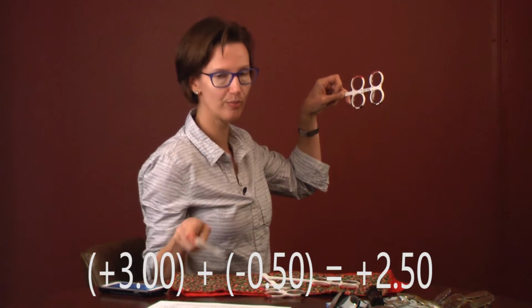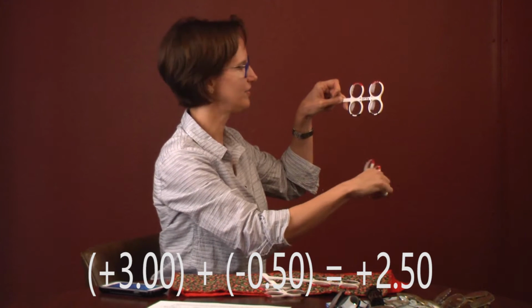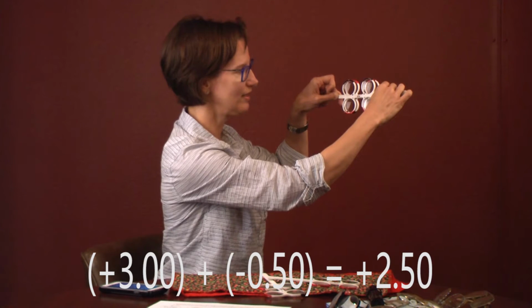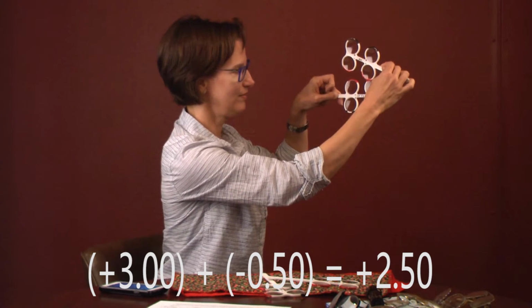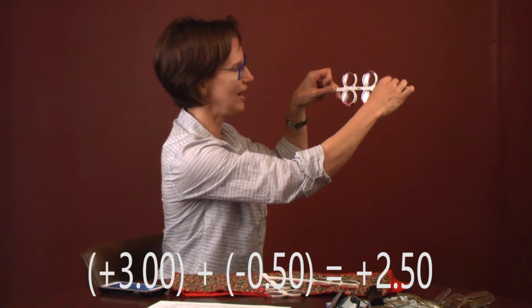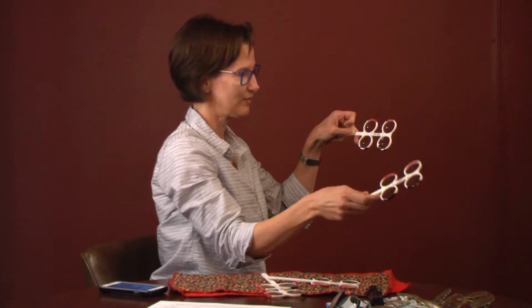Then you can take your 0.5 and fine tune it up or down from that 3. So you can add the red, which is a negative, to that, and then separate it, and whichever one they like better. They might like this would be a positive 2.5, and if they like that better, you're going to write that on your piece of paper, and that's what they'll take to the optical and go get those glasses.